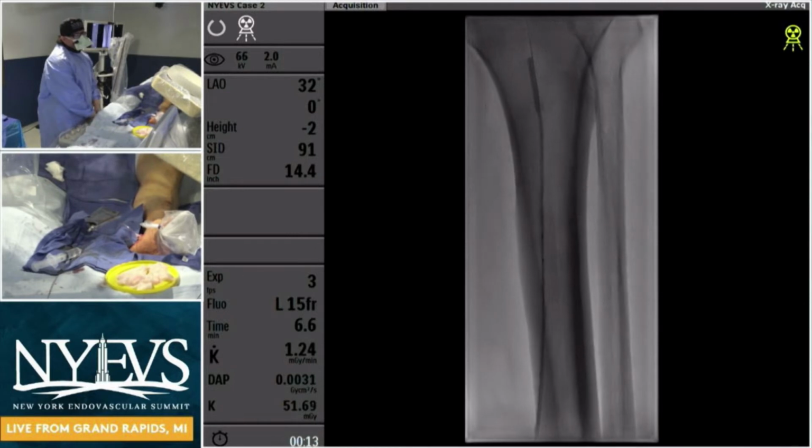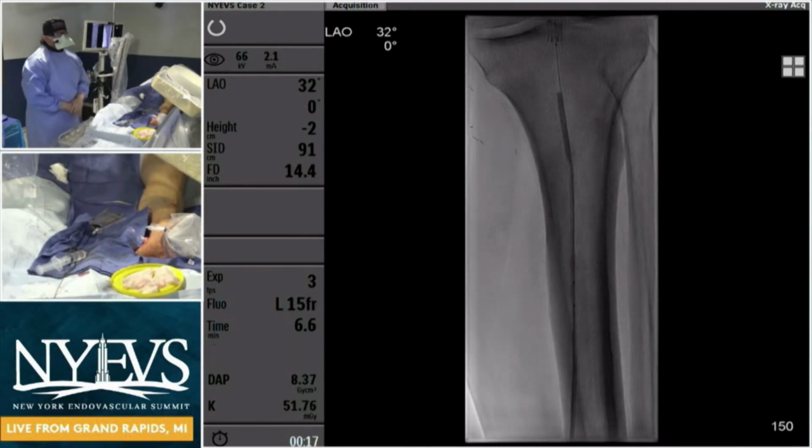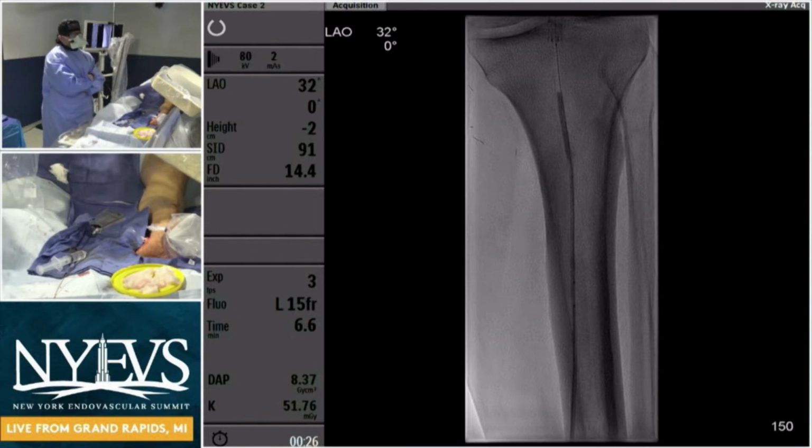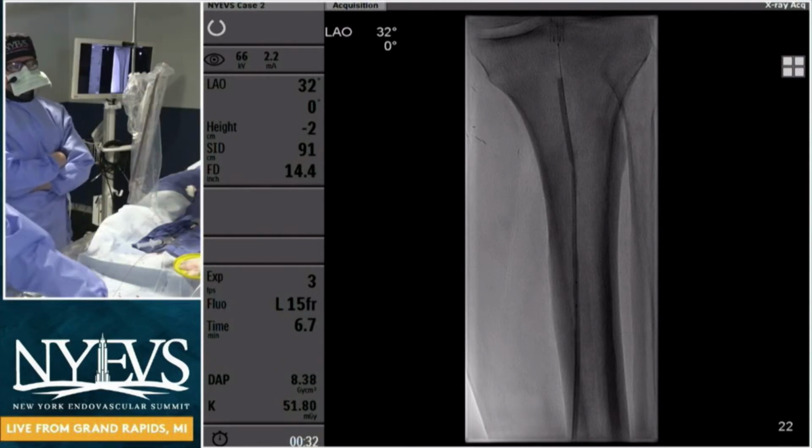I think if I was using a 4.5 Slender, I would have probably done an atherectomy and a DCB directly, because I don't think a laser with 5 French would really do much for a vessel of that size. If I was doing a 6 French or a 7 French, then it's a different story. But if it's 4.5, I would probably just do a cutting balloon, Serranator, Chocolate, and then just be done.